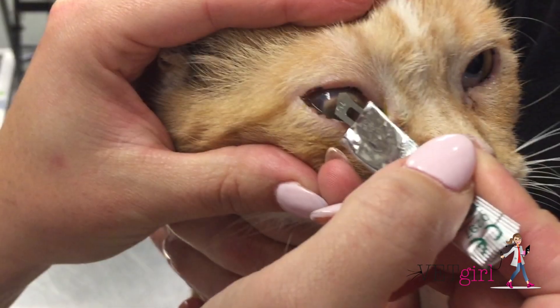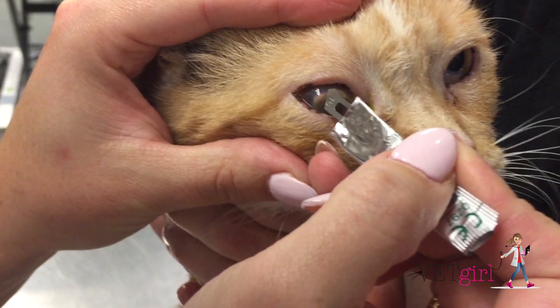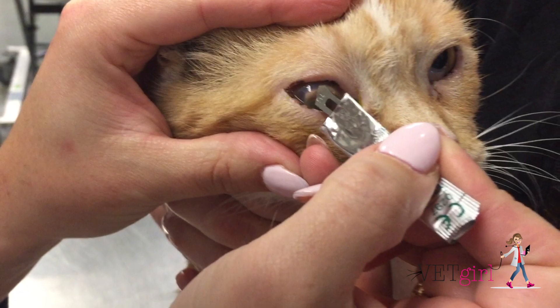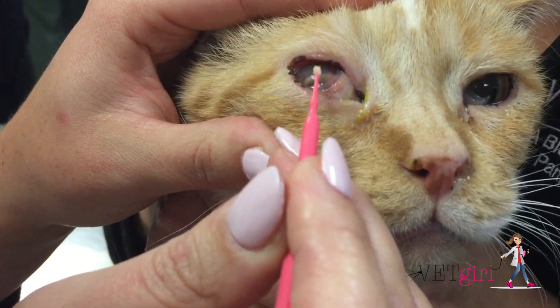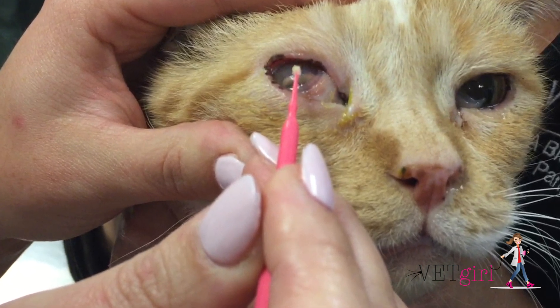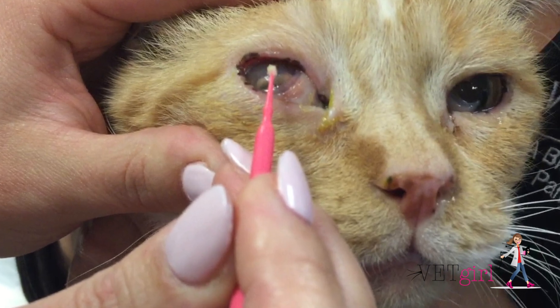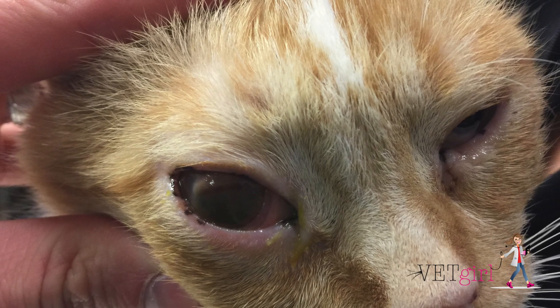In this Vet Girl video, we demonstrate how to perform corneocytology collection. Corneocytology can be quite helpful in diagnosing certain disease processes, such as bacterial infection or eosinophilic keratitis.